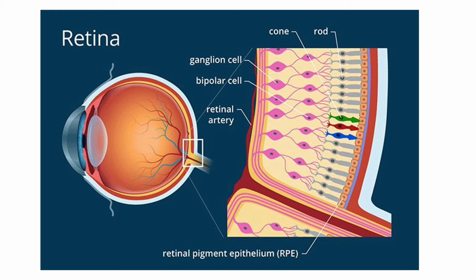Specifically, how retinal tissue reflects light at different wavelengths can be a physiological indicator. For instance, amyloid beta is a biomarker for Alzheimer's disease because it accumulates over time in the retinal pigment epithelium, or RPE, and is correlated with brain amyloid beta levels. Hadoux et al. in 2019 found there were significant differences between control and transgenic mice with their amyloid beta levels between the retina and the brain. So this technique is very powerful for understanding certain diseases.